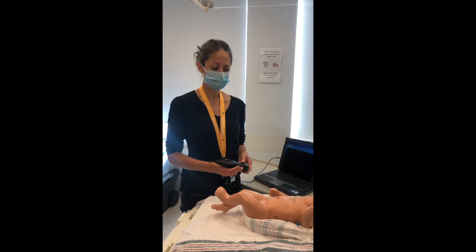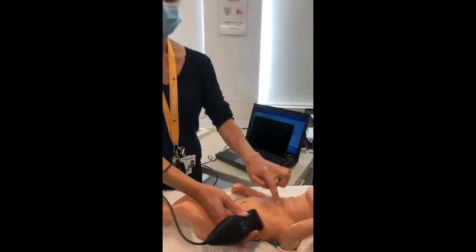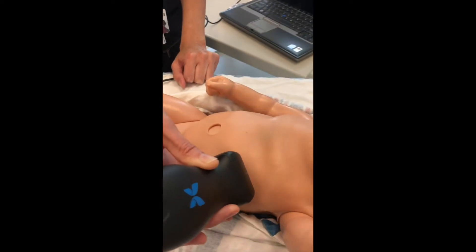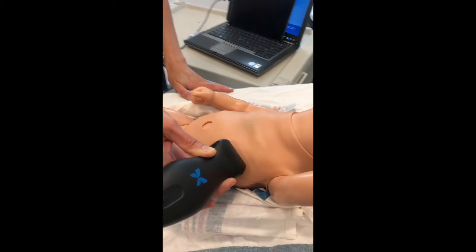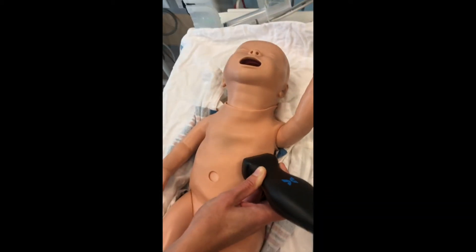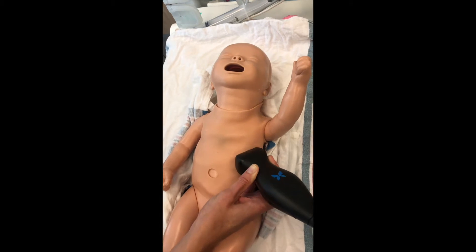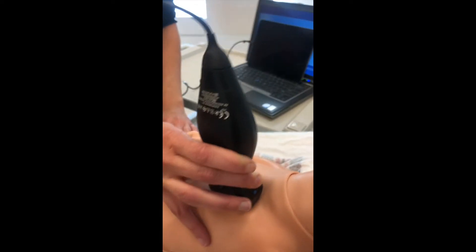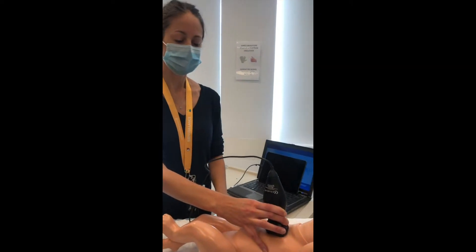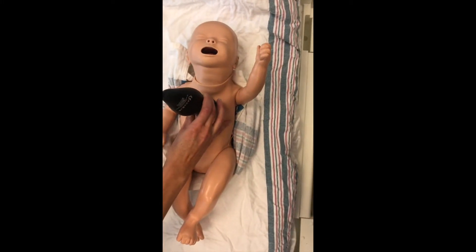Now that we are installed, we can start the ultrasound. The first view will be the apical view. You have to go on the left side of the baby and you need to get the heart from the apex. The second view that we will do is the short axis view. You need to move your probe more to the middle and you will obtain the heart from the superior view, and you can have both ventricles contracting and move from the top to the apex.